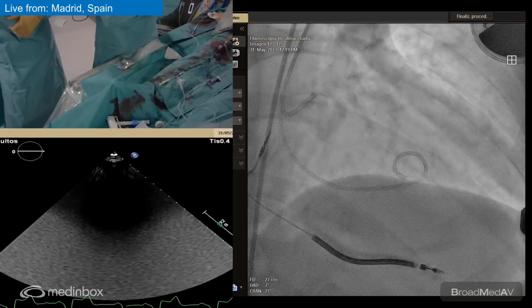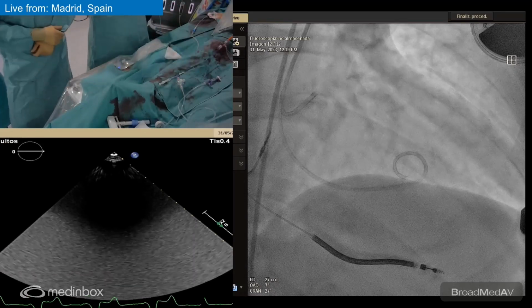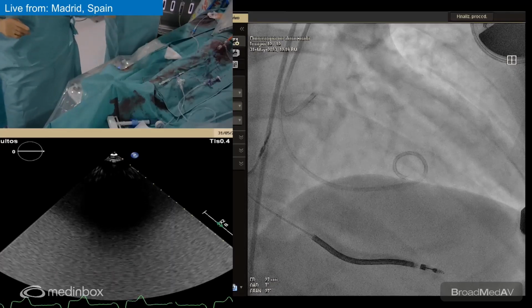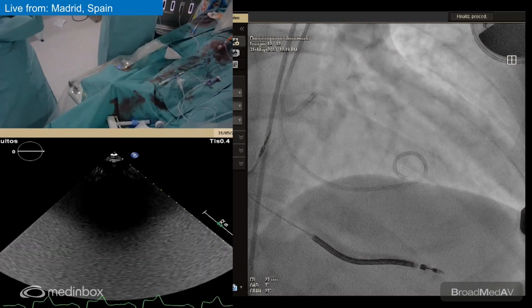Yeah, that's important because sometimes you expect an immediate effect, but you have to wait for the remodeling of the infarct. The next day echo is usually very bad, but echocardiography at 3 to 6 months is what counts.